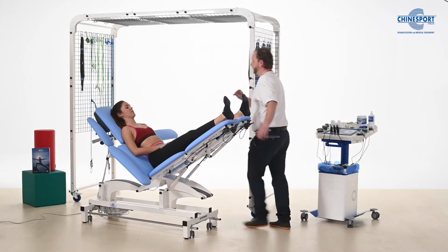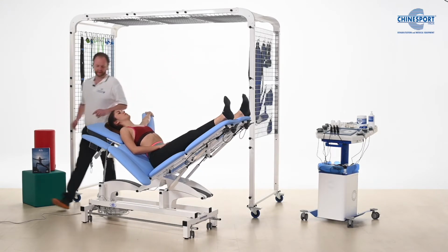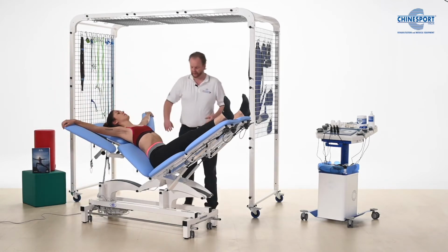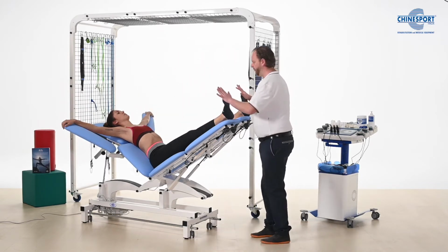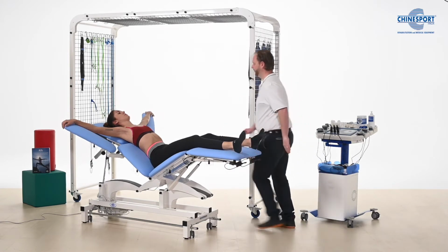Okay, we can also combine this with abdominal breathing, and we can go back again. And if you put your hands up here and up here, then she's really stretching, also opening up here and here, and that helps feel how breathing patterns and the deep myofascial system can affect all the muscle chains. We'll go back out of that and go into here.